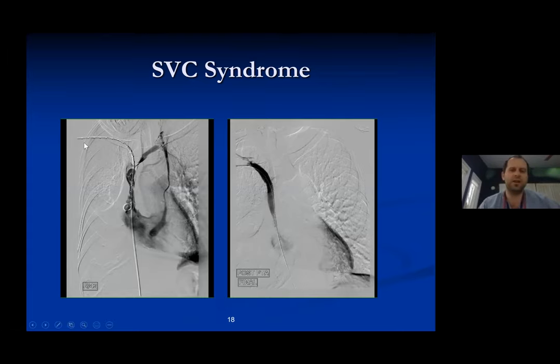And in this case, you see an angiogram. There's a catheter that came up the right upper extremity. We were able to cross the area of narrowing, and it's markedly irregular. There are probably some, obviously, clots here now. There are collaterals, chest wall collaterals, pericardial collaterals, coronary vein collaterals. And after our magical treatment, which in this case usually involves performing a thrombolysis/thrombectomy and stent placement, we have provided now inline flow and venous return back to the right atrium.